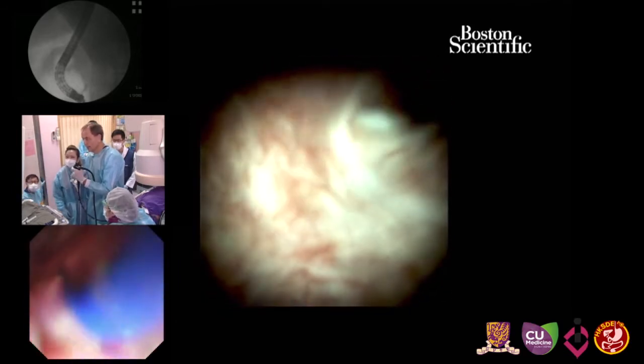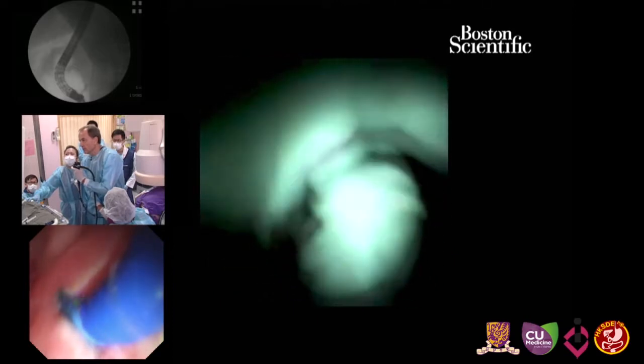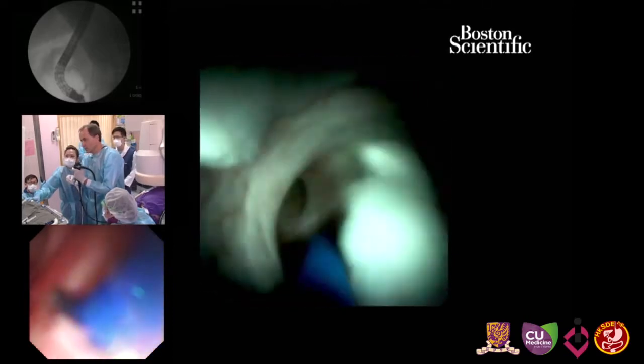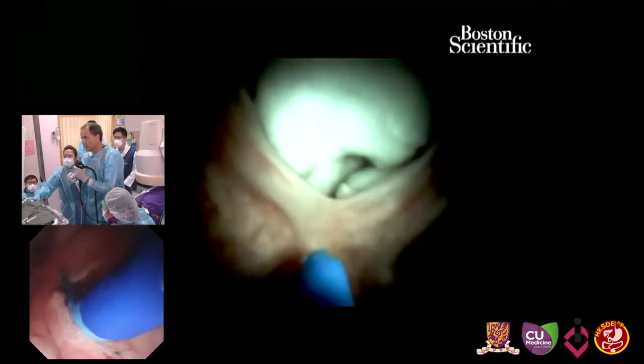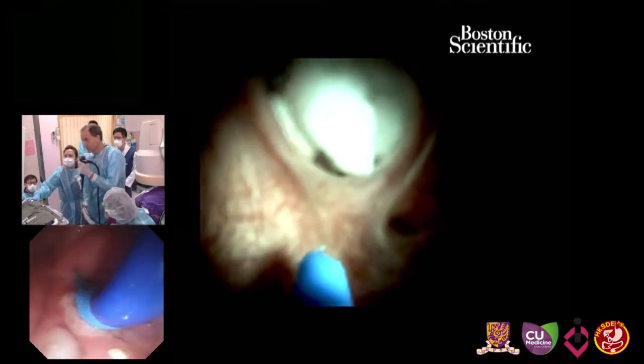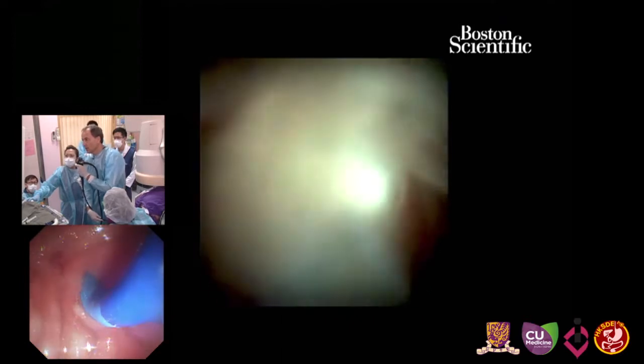And you see, I maneuver the scope, the stone is already broken. I can crush it into even smaller pieces now, but it's completely broken, as you can see already. I try to target the larger piece here. We can nicely see all side branches.